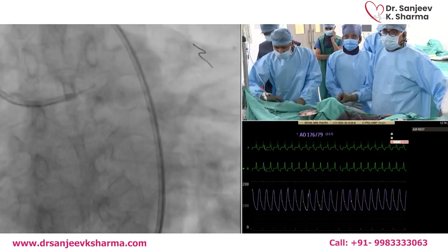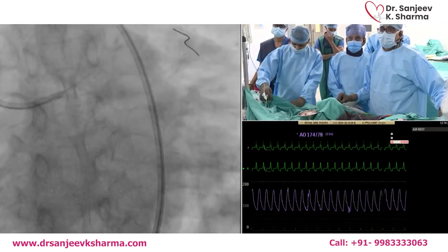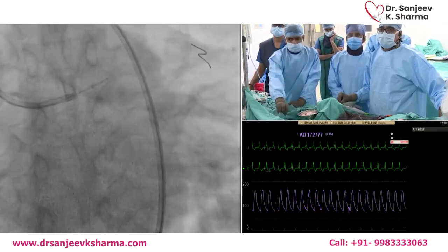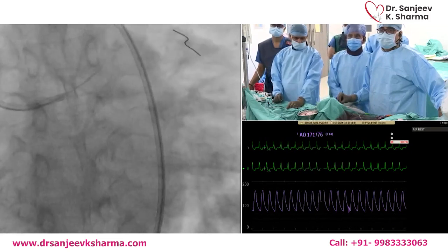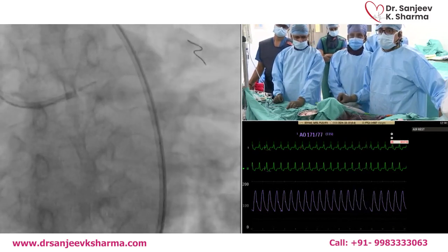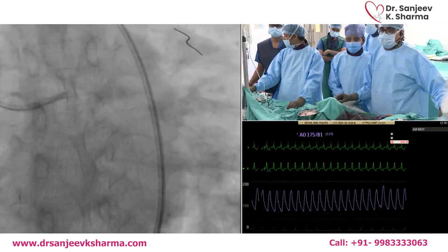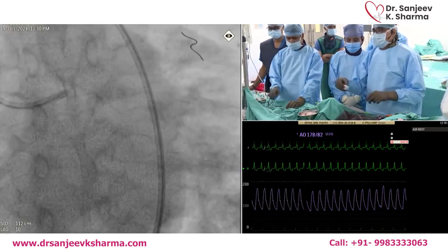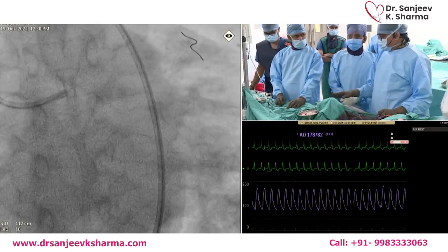So if orbital is the lead, it's kind of dealer's choice at the time, to show what the new technique is. But otherwise this is a beautiful case for rotational atherectomy plus or minus IVL. But I think in this case after rota, we'll just do a rota, then a cutting balloon. If the lumen is good and expands fine, why do you need to increase the cost with IVL, knowing that IVL cost is incremental, both in America as well as India?